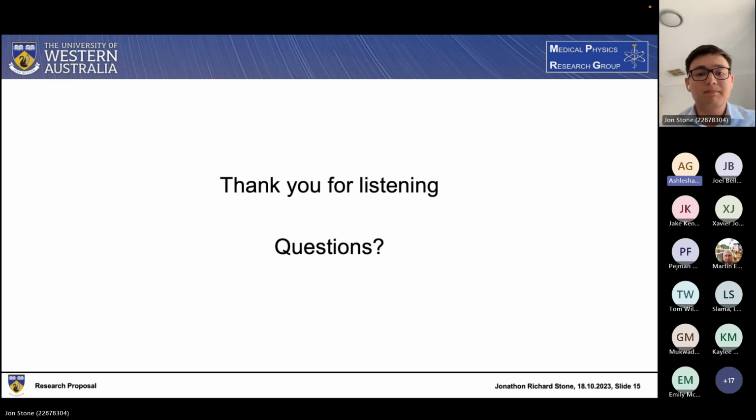My question was, regarding the simulation of bone in the phantom while you're printing it simultaneously, can you give a bit of detail on what parameters and infills you used for that? Yeah, so we've selected stone fill PLA, which is PLA that's got 37% ground stone in it, which offers a higher density and higher attenuation compared to normal PLA.